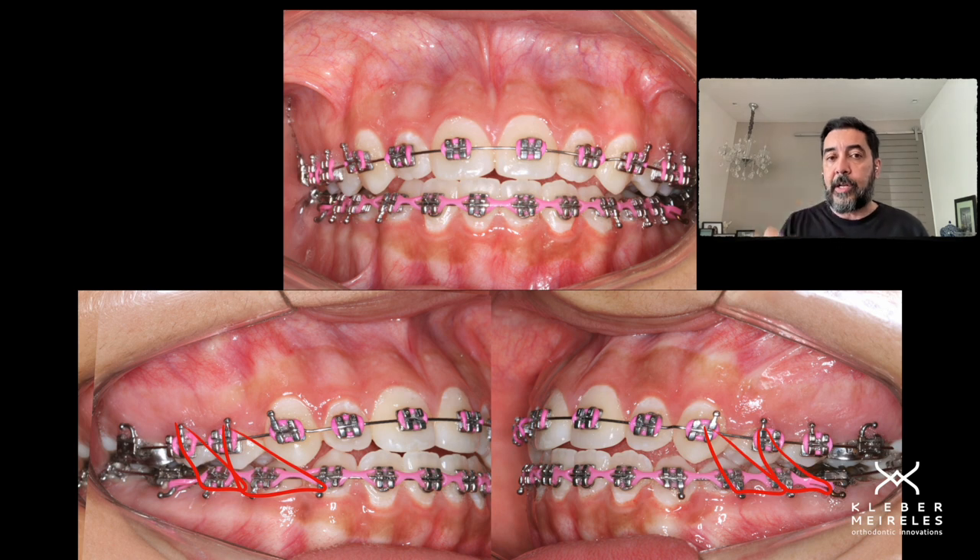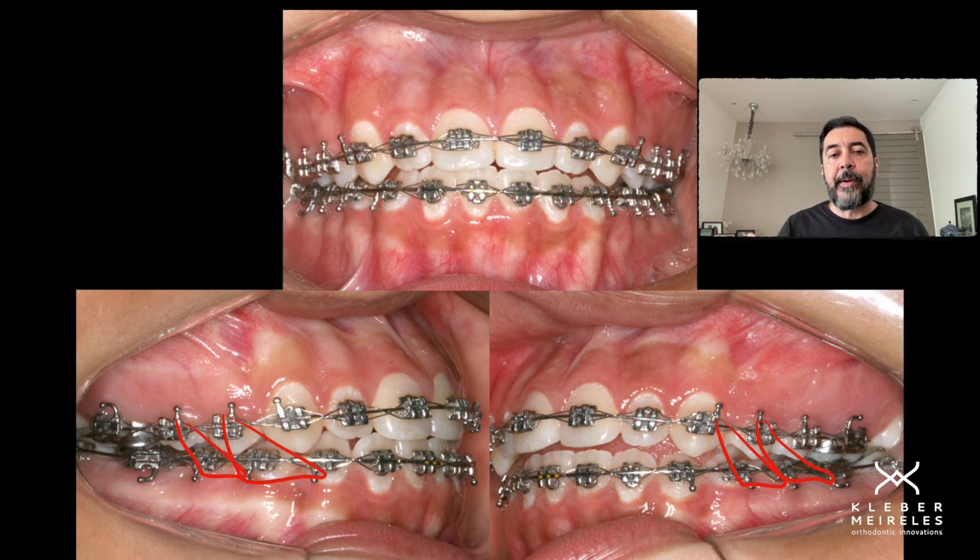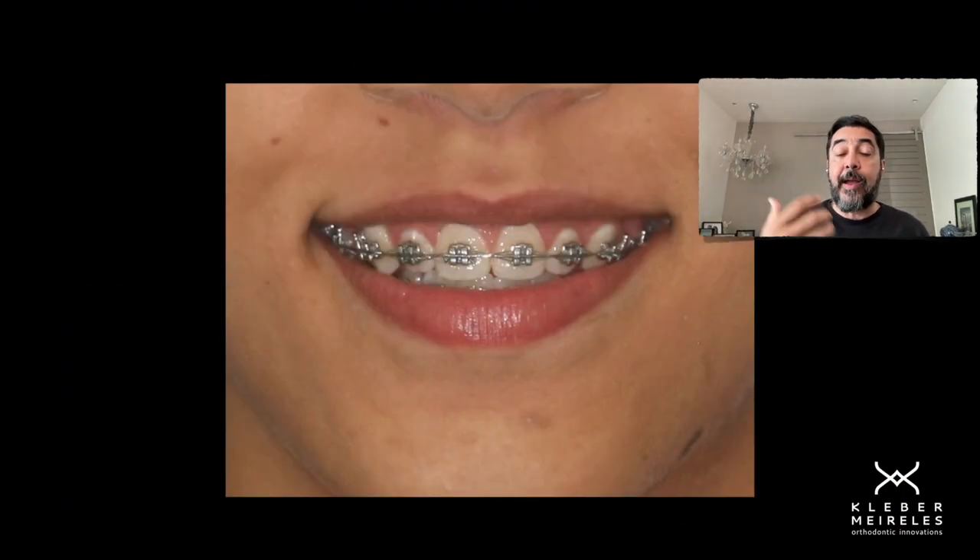Keep those elastics for fewer hours per day — like 12 hours per day maximum — for at least three months. The open bite is being closed, and now we have good positioning of the anterior upper teeth. Now we need to create a better smile arc, and we could refer this patient to cosmetic dentistry for that.